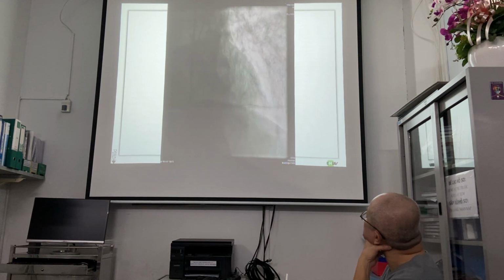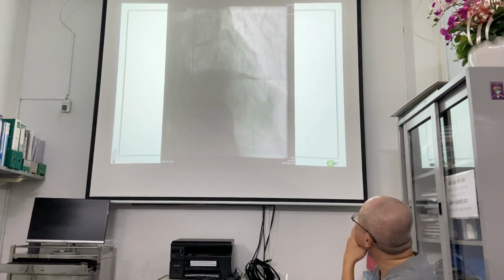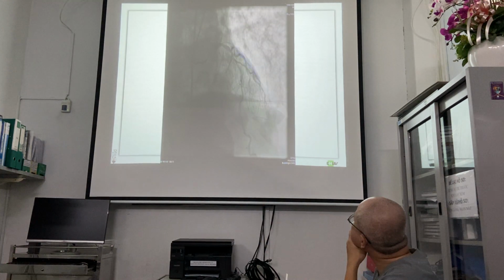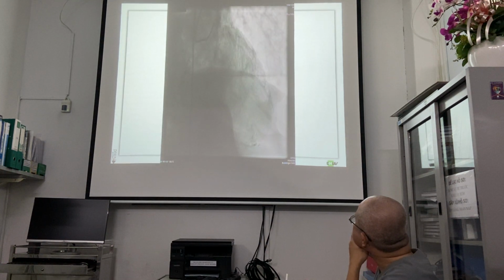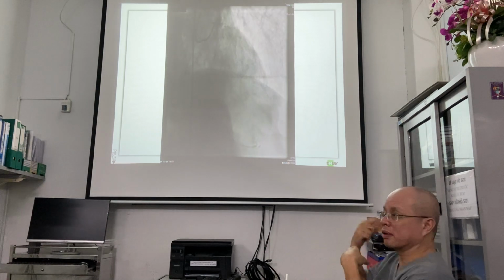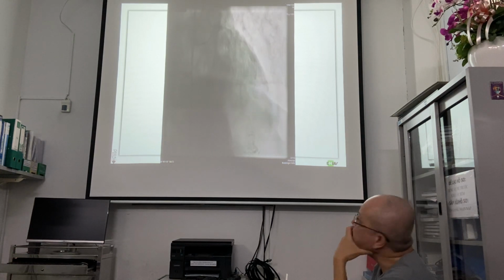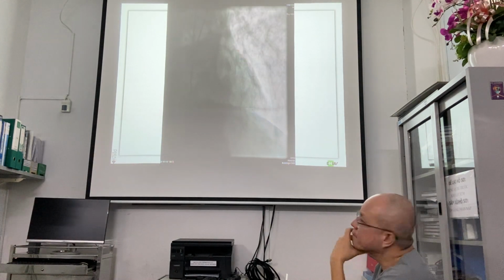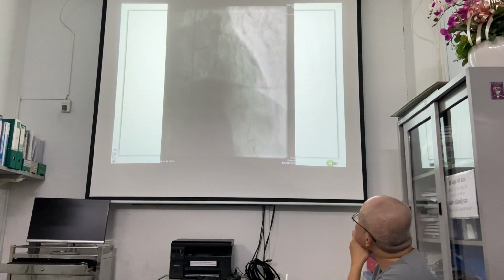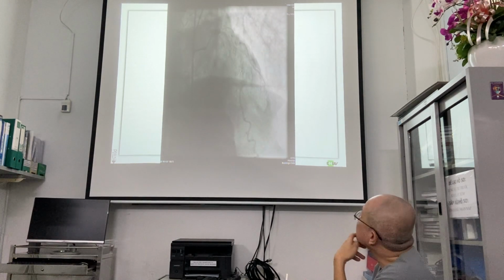Yeah, that may be a point. We will come to that later, but first of all, where is Lucas now? Do you think, because the heart is moving? Yes, you're correct. So just look at what we see. First of all, the heart is moving again. So everybody happy? We can take off the Lucas, the heart is moving again, the patient has blood pressure again, so everybody's happy. Okay?